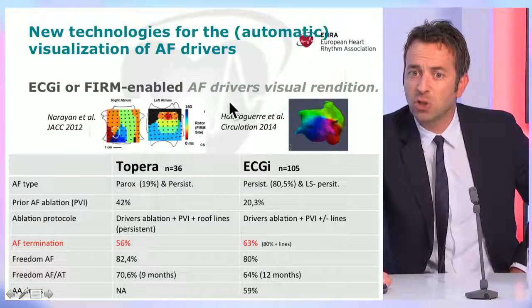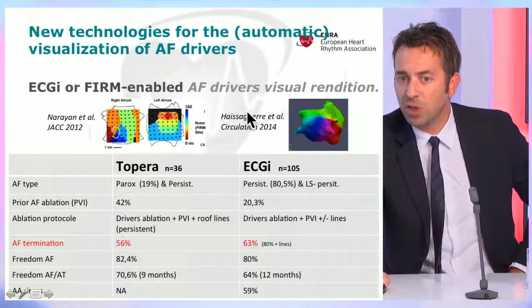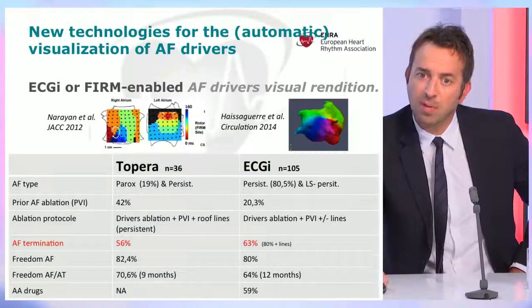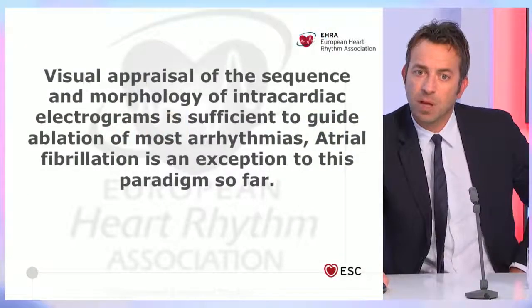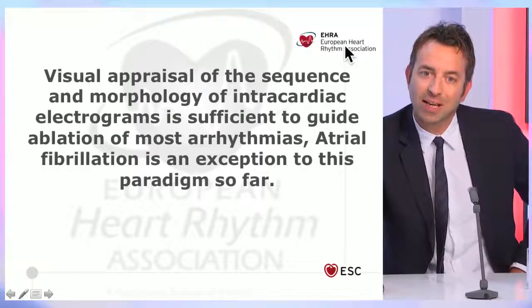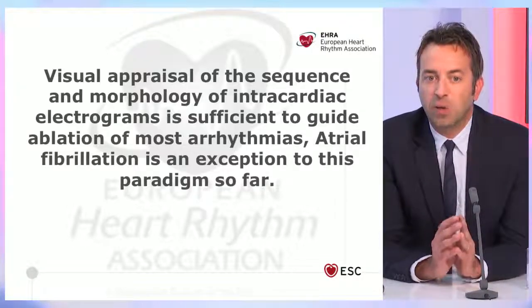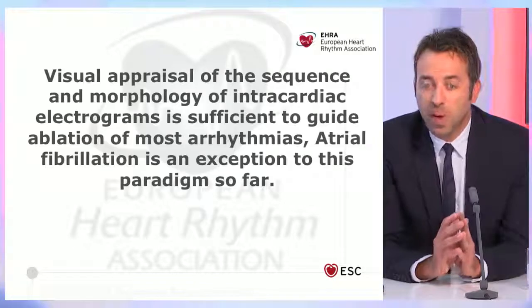This publication opened a new way of thinking in the field of AFib ablation and in the field of mapping drivers. Visual appraisal of the sequence and morphology of intracardiac electrograms is sufficient to guide ablation of most arrhythmias. Atrial fibrillation is an exception to this paradigm so far.